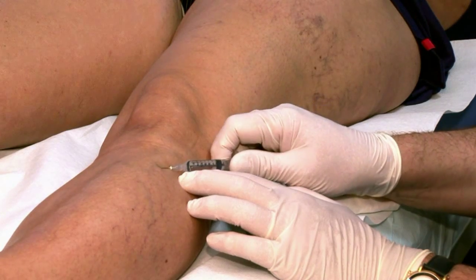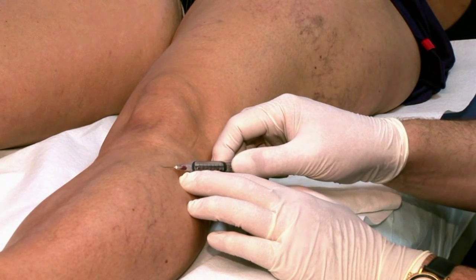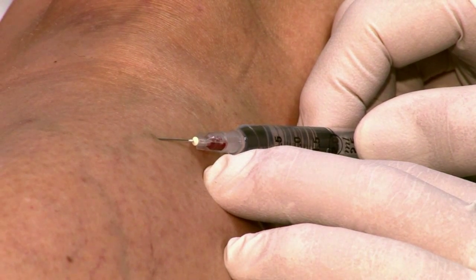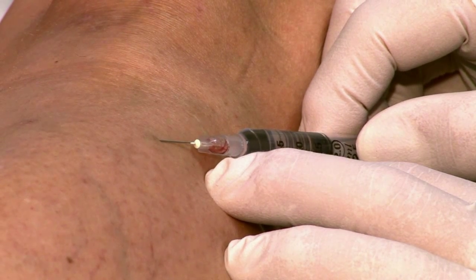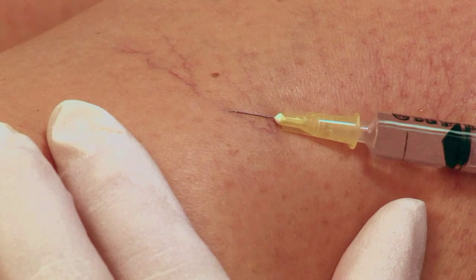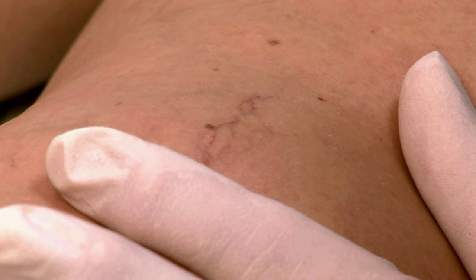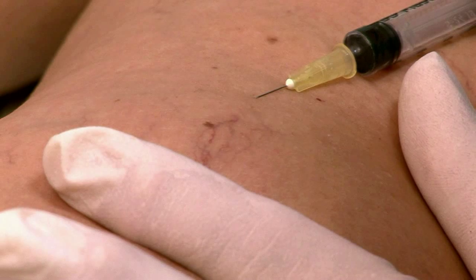for the injection. The aspirated blood flowing back into the syringe shows that the cannula is in the correct intravenous position. Aspiration is not usually possible for telangiectasias, but it is recommended for reticular varicose veins. Paravenous injection should be avoided. During the injection, localized decoloration of the veins occurs, as the injected sclerosing agent displaces the blood in the veins.